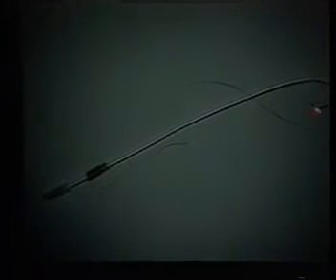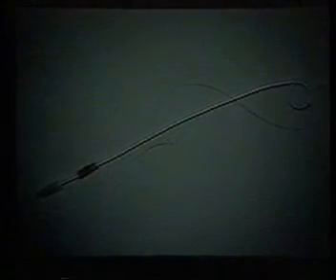And usually the catheter is some type of a retention catheter, either a pigtail Cope-type nephrostomy catheter, as you see here, or more recently they have developed, or Drs. Mueller and Van Sonnenberg have developed, specific empyema drainage catheters which have a gradual retention-type curve to their tip, which are specifically meant for empyema and abscess drainage.